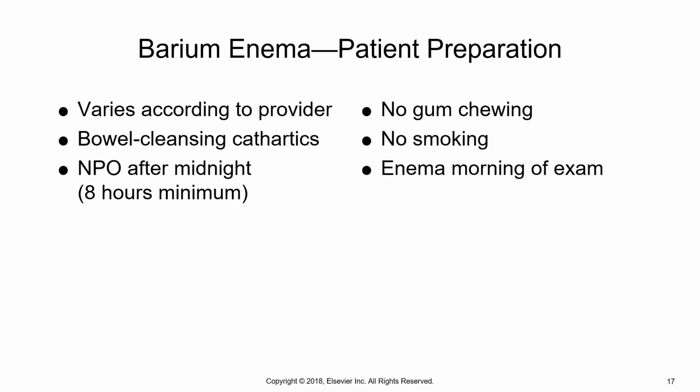The patient's prep for a barium enema typically varies according to their provider. But the bottom line is they need the entire large intestine cleaned out, empty, free from any fecal material so that imaging can take place.